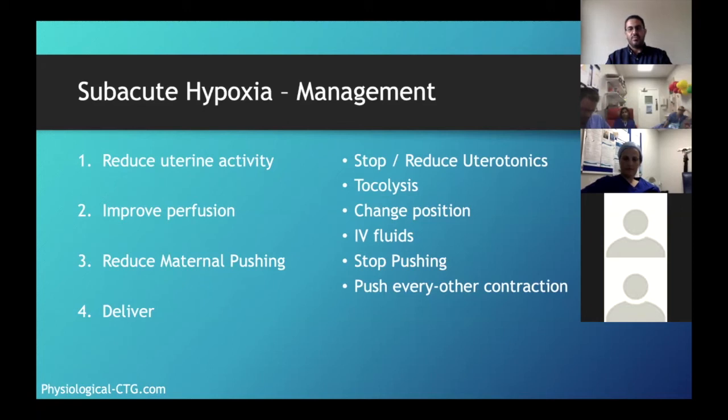So baby spending less time at the baseline and it's getting less and less, that's a sign of worsening. Baby's variability during the deceleration is getting more hypervariability or flat, that's a sign of worsening. You give terbutaline, the baseline will go up most of the time, but your sign of improvement is that the baby is now spending a little bit more time at the baseline.